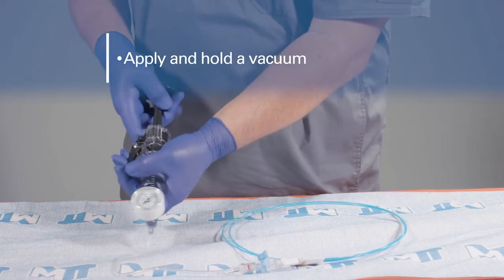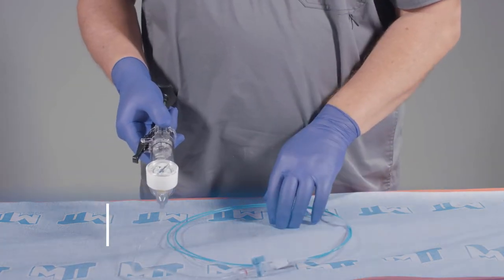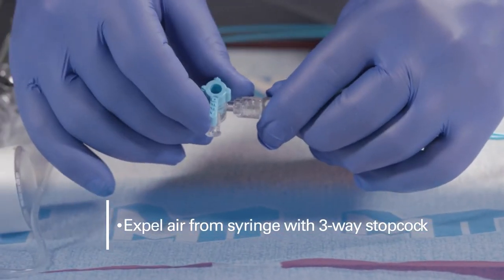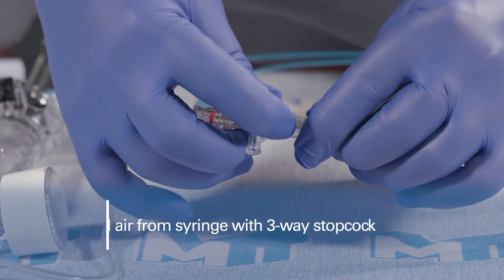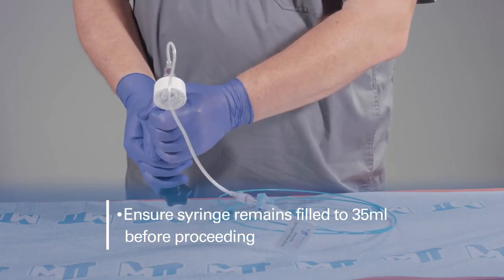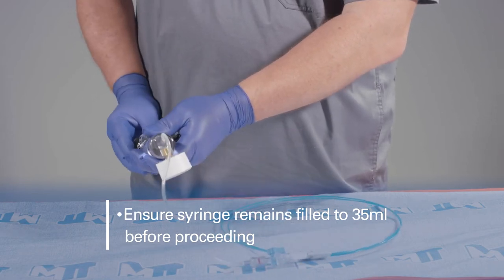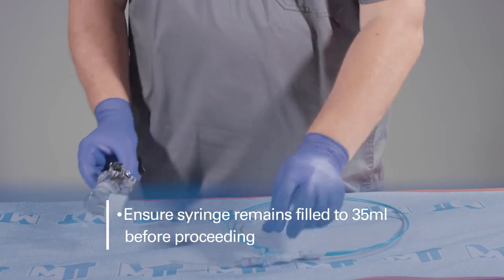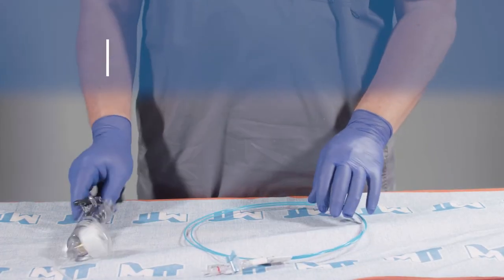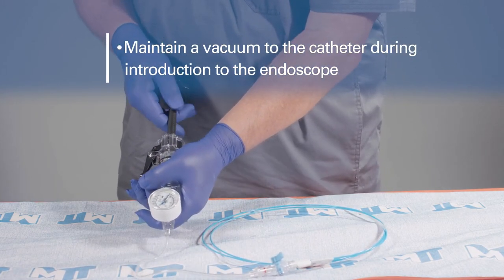Apply a vacuum to the syringe to purge air from the balloon catheter. Use the three-way stopcock to expel air from the syringe and ensure the syringe remains filled to 35 milliliters before proceeding. Applying a vacuum prior to introducing the balloon catheter will assist in passage of the balloon into the endoscope channel.